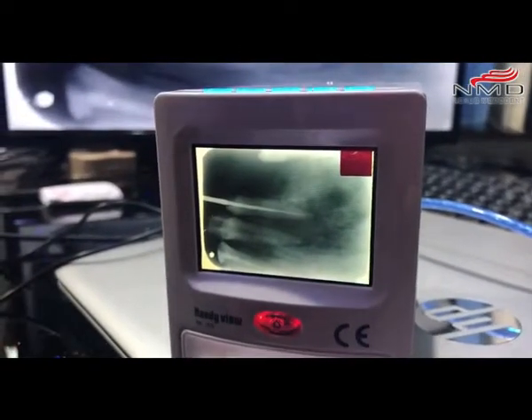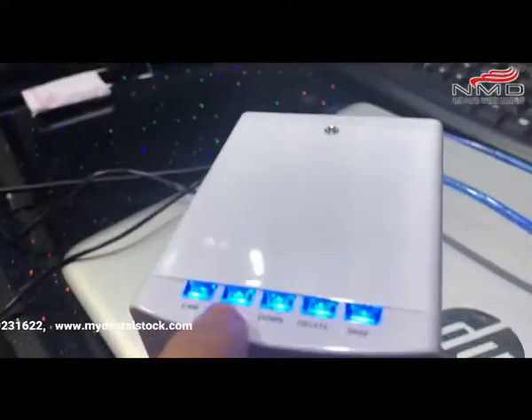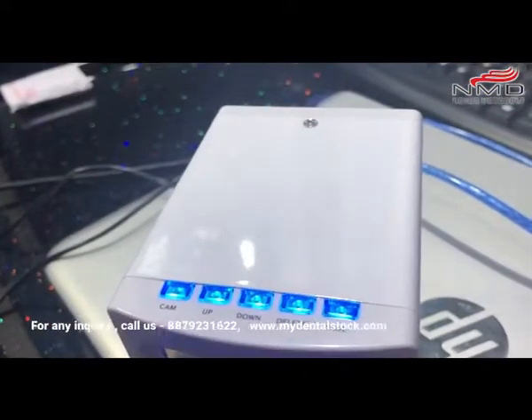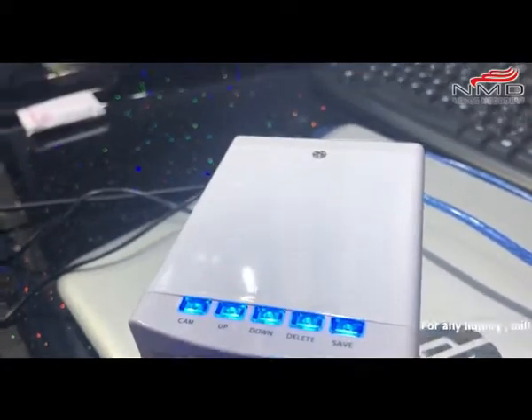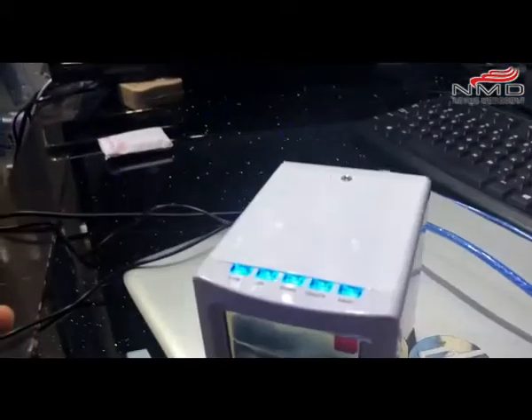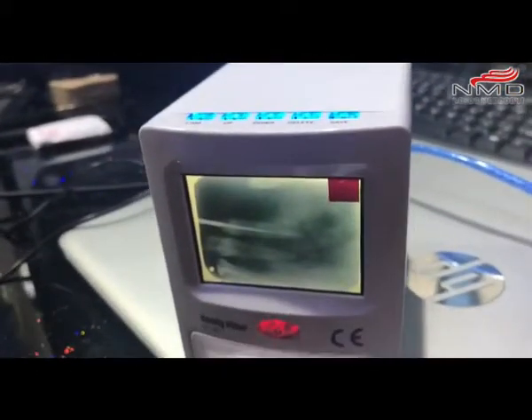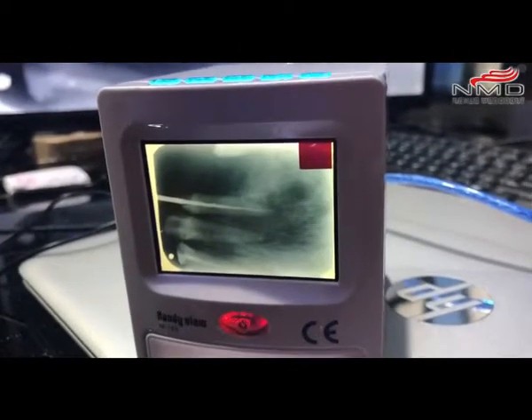I can view it, zoom in, and save it. There are options here: camera, up, down, delete, and save. If I press save, it will be automatically saved to the SD card. This is a handy device from Nexus Merodent, and it's not even 10% of the cost of a sensor.